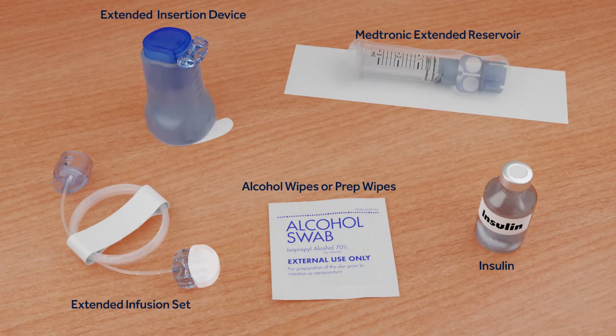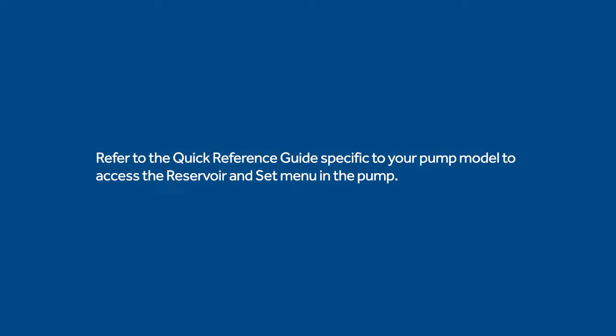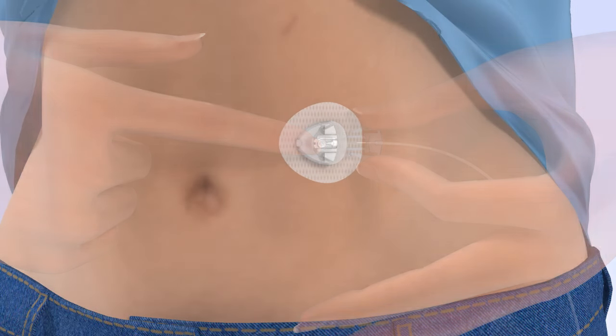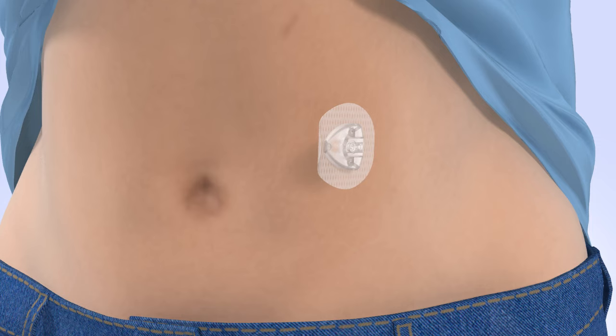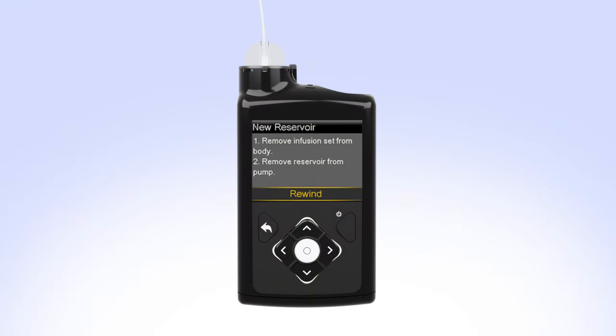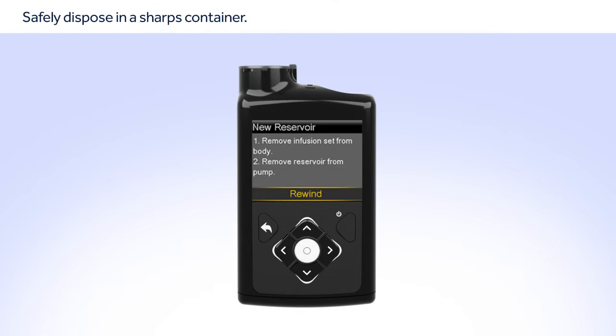Before you begin, wash your hands and gather the items you will need to change the reservoir and infusion set. The first step is to access the Reservoir and Set menu in your pump. Refer to the instructions in the Quick Reference Guide specific to your pump model. Remove the infusion set you have been using by loosening the adhesive and pulling away from your body. Then remove the reservoir from your pump by turning the tubing connector counterclockwise. Safely dispose of the used infusion set and reservoir.